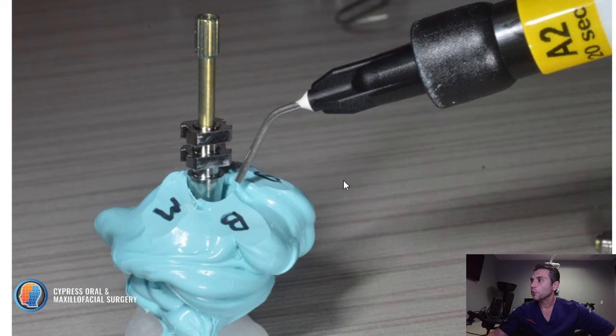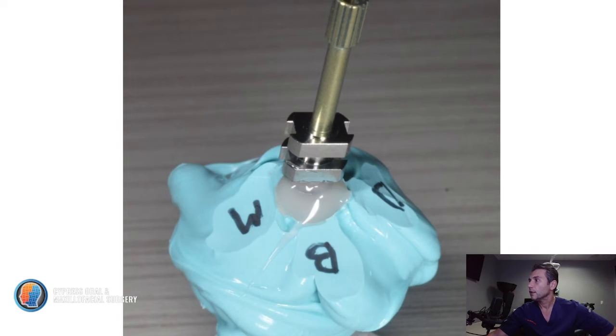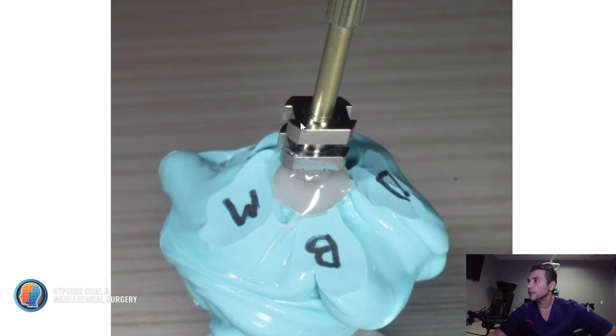Here it is. I use flowable composite. It flows very, very well, and then I cure it. And that's what it looks like. If you have any space in the back of it, in this case we don't, but if it's a big central, you definitely will have space there. Fill it 360 degrees all the way around.